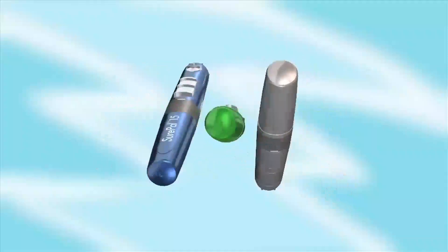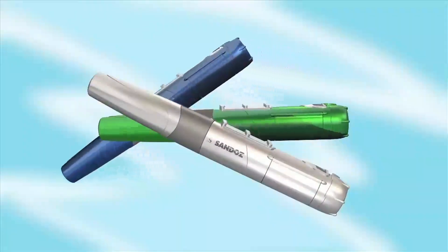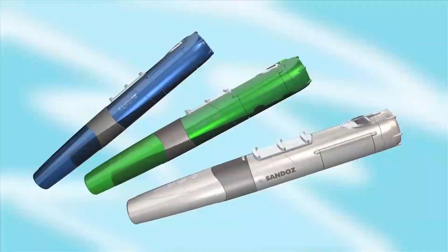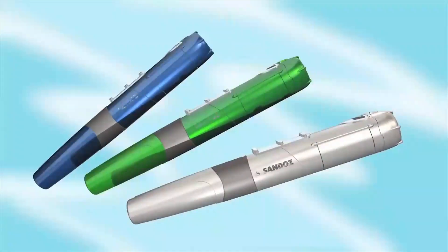This video will show you how to use your SurePal, a special device that's just for your Omnitrope. This video uses a green SurePal, but depending on your prescription, yours might be white or blue. No matter what colour you have, all SurePals work the same way.